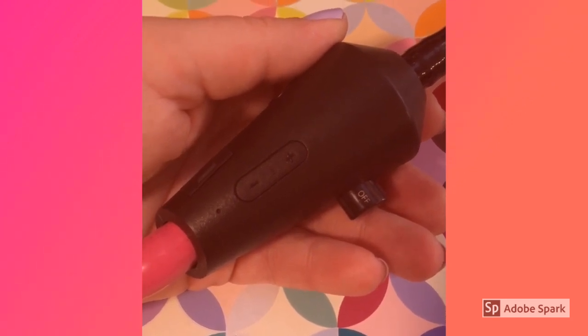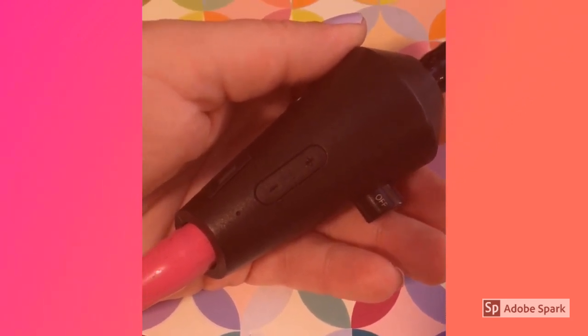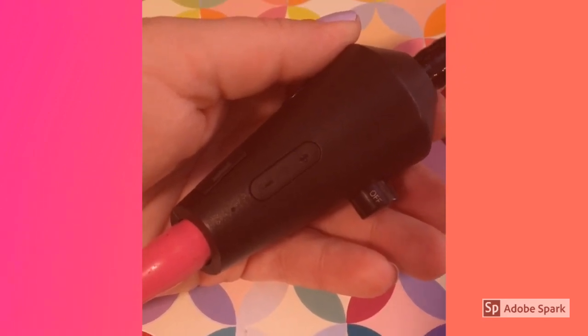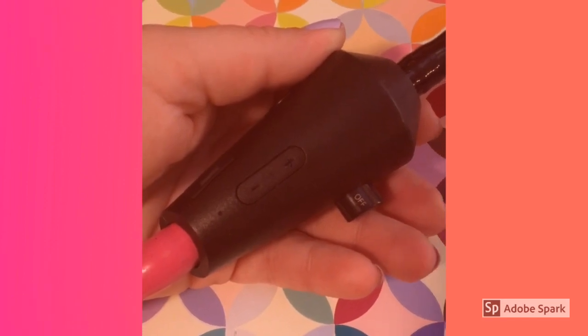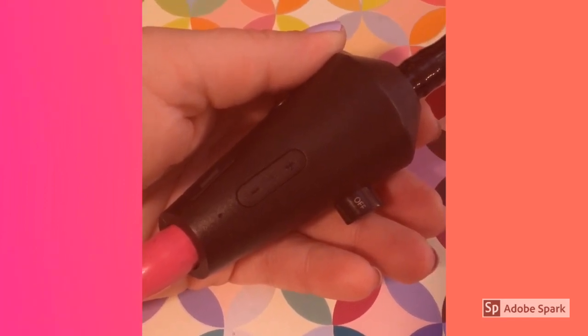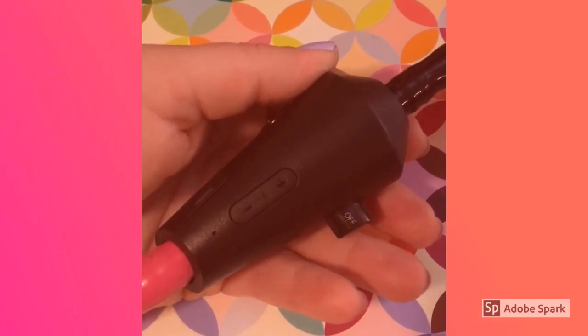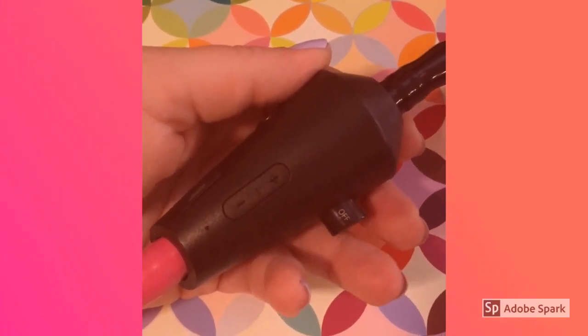Much like any device with a volume control, you don't just want to crank it all the way up. About mid-level I seem to get the clearest, most desirable sound. Also, you want to make sure that you're not listening over clothing — you're gonna get a lot of feedback and rustling of the fabric. If you're directly against the skin, you get a nice clean amplified sound.